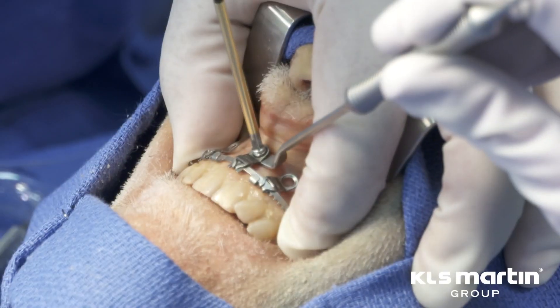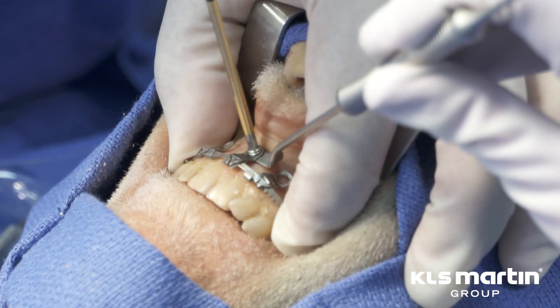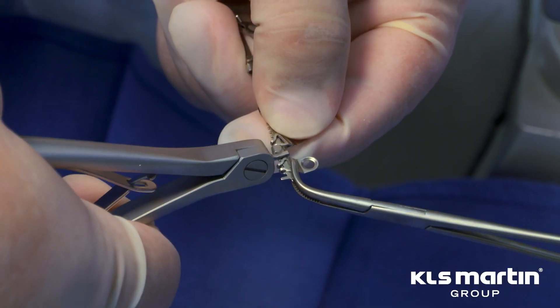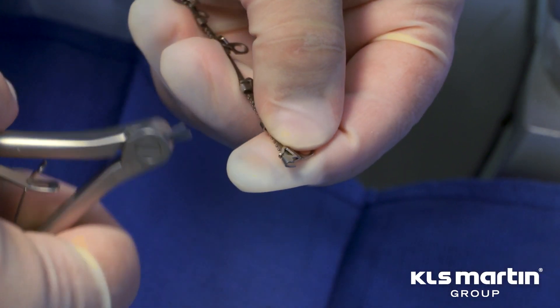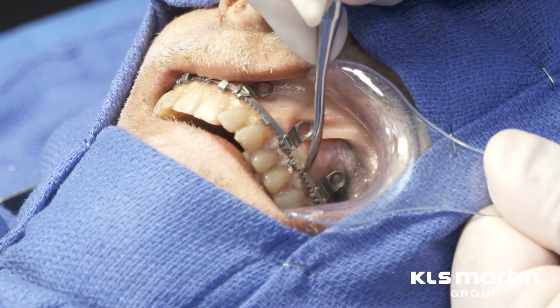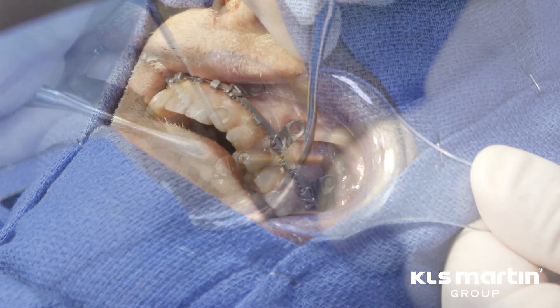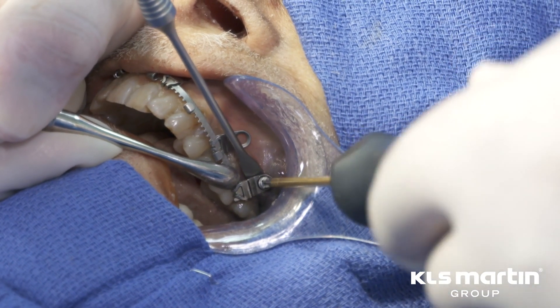When using the fixed midline arch bar, first place the medial screw then work laterally. The last slider plate will be medial of the last hook. In cases where fixation is only desired in the first molar region, the last segment is sometimes removed. However, in this patient there is adequate space and access to place fixation in the posterior molar region. For maximum rigidity of the arch bar, the ideal placement of the slider plate is positioned as close to the last hook as possible.